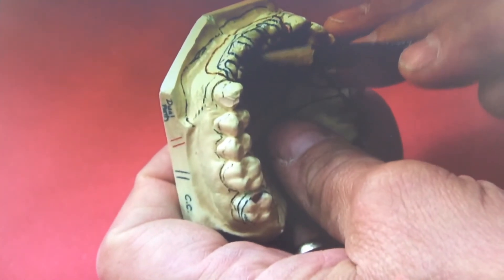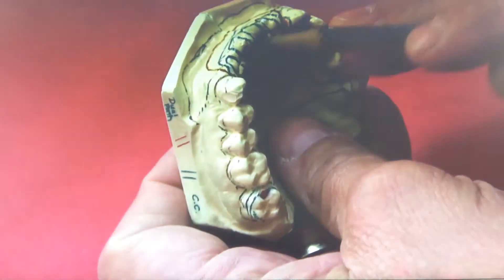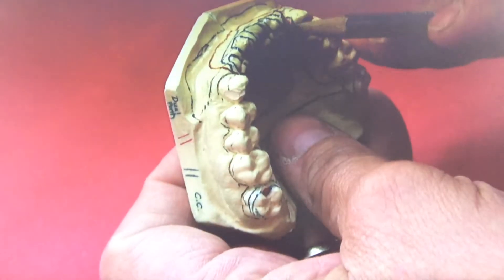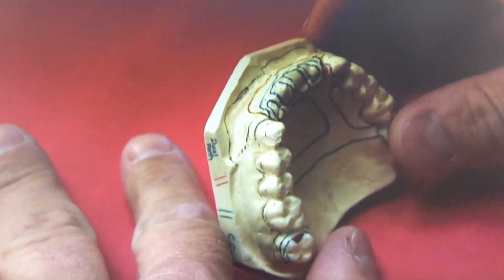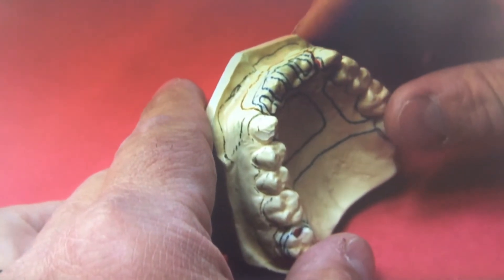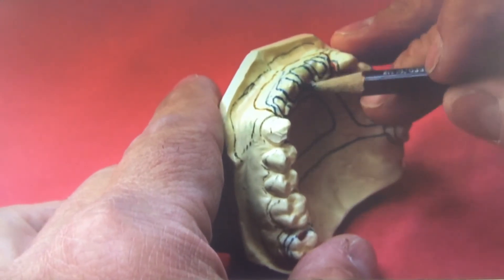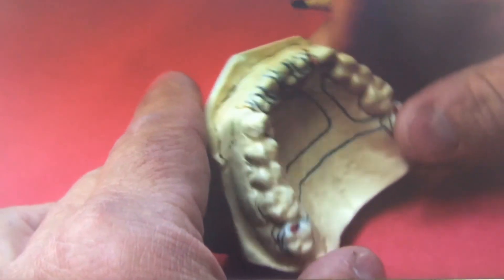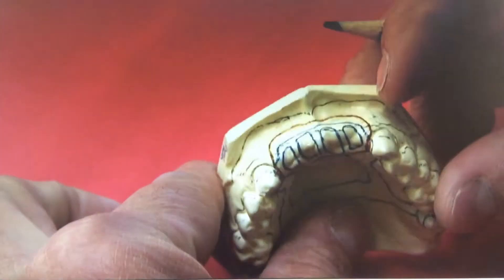There are no strict guidelines for the size of these windows — roughly the size of two centrals and two laterals, with smaller ones on each side. The lab will position them anyway. As long as you indicate which type of mesh you want — in this case an open lattice — they're going to give you what they consider standard, so just indicate your preference and you'll be fine.